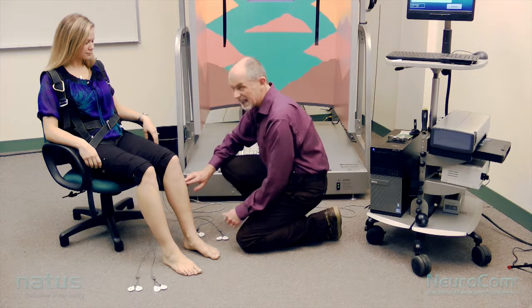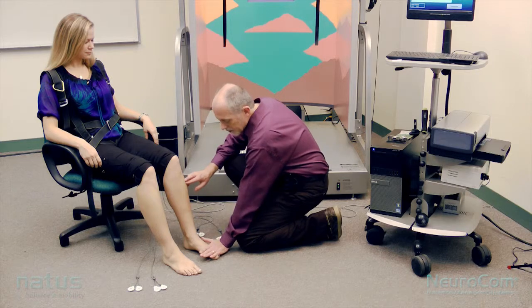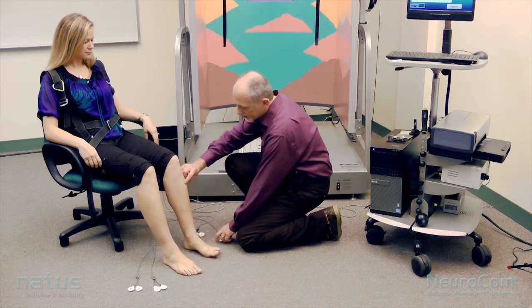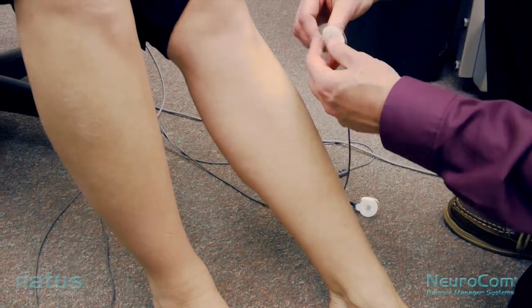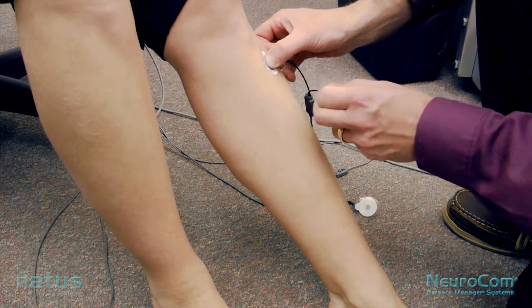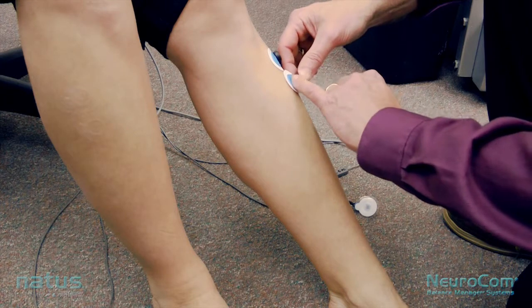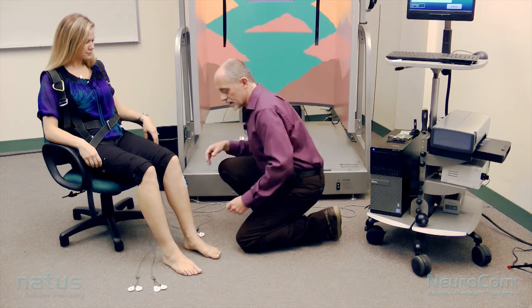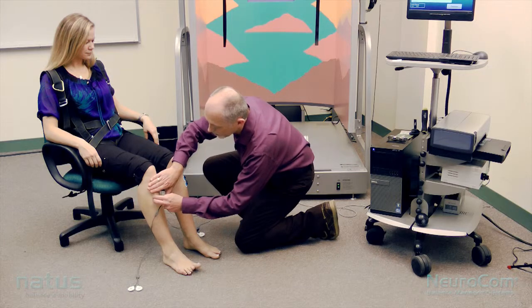To place the electrodes, take four fingers down from the knee joint — that will get you roughly in the right area for tibialis anterior. You want to find the belly of the muscle. Easiest way to do that with the patient sitting is to ask them to push up against your hand, which causes that muscle to pop out. This is a dual electrode array. Standard placement using these MVU electrodes is to place them butt up against each other, right over the belly of the muscle.